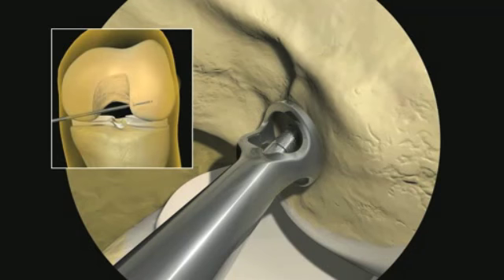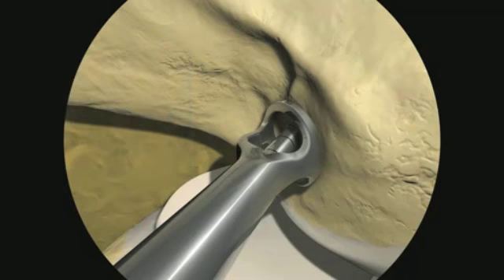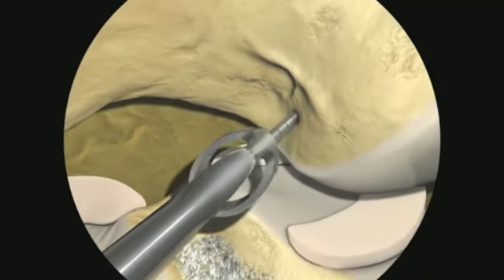Advance the guide pin to the lateral femoral cortex, noting the aperture to cortex depth, then advance out of the skin. Continue advancing the guide pin out through the skin laterally, using a twisting motion to remove the femoral footprint guide.